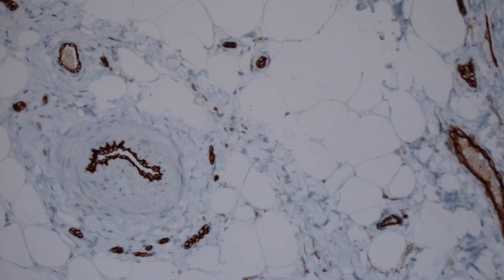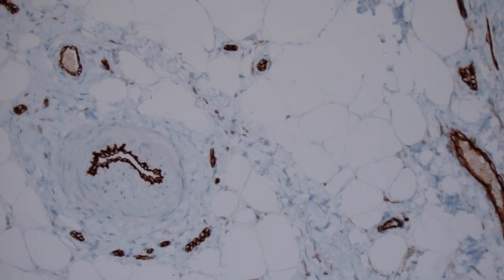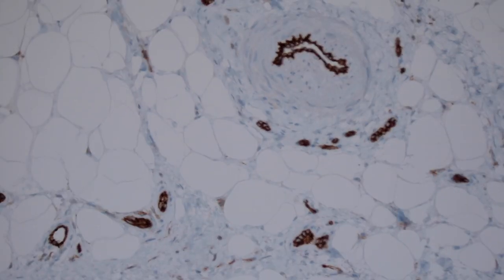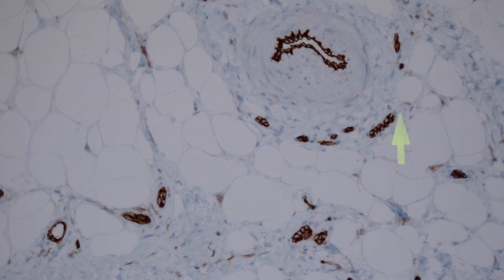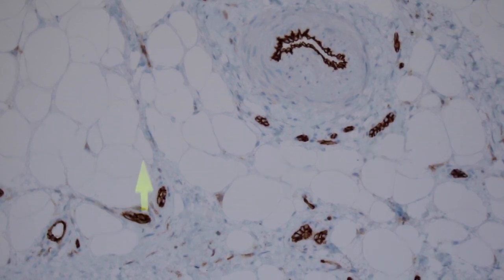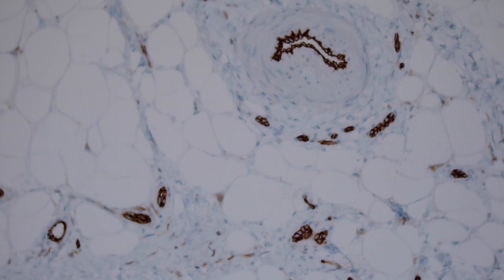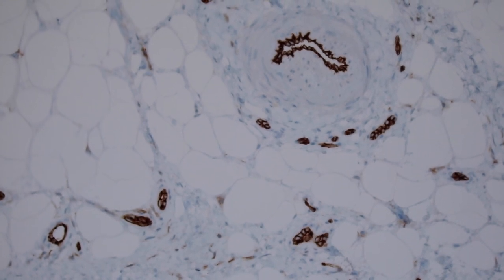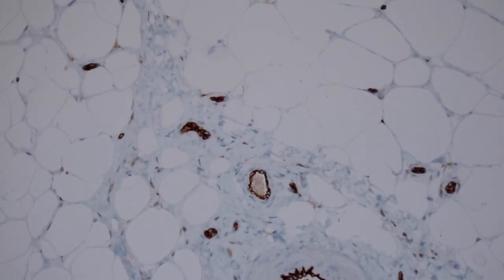So again you can tell that the inner lining and the wall of the vessel are actually made of different components. And you can see all these little vessels around here, these smaller capillaries, they all have the lining cells, the endothelial cells are staining with CD31.